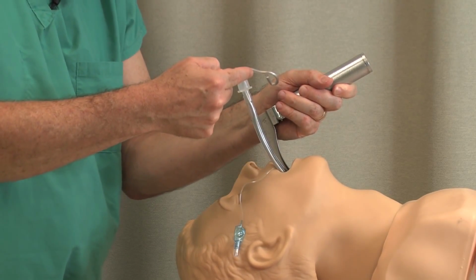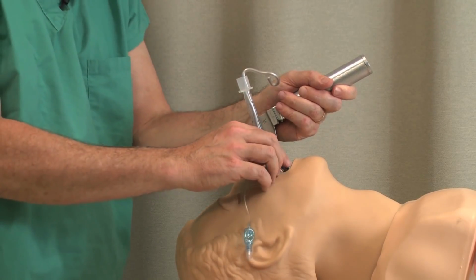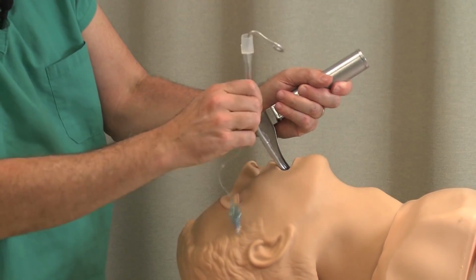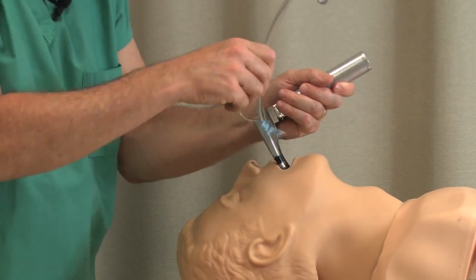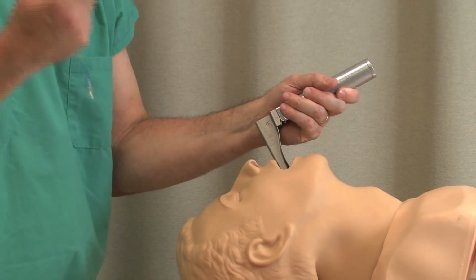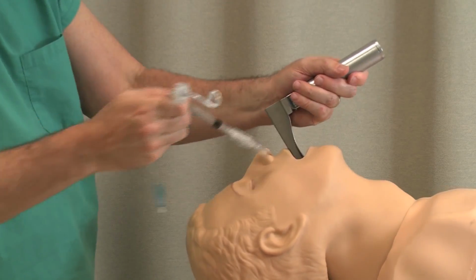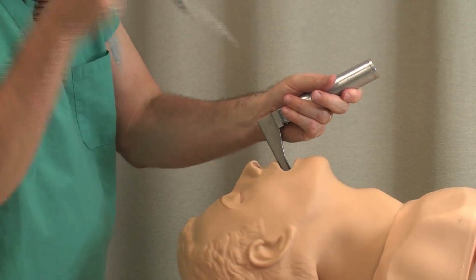Do you need to have a stylet? I would argue that you do. Some would say you don't always need it, but I think it's a good idea to have a stylet. You need to have just enough curvature to be able to make that turn. You don't want to be going boink, boink, boink. Remember, every time you go, that's friable mucosa down there. It's very delicate vascular stuff. If I'm going like this a whole lot of times, I'm going to stir up a lot of bleeding. And then it gets edematous, and then it's hard to see, and you just end up with a vicious circle. So as much as possible, try to be real gentle with this stuff. You want to lubricate the endotracheal tube before you put it in.